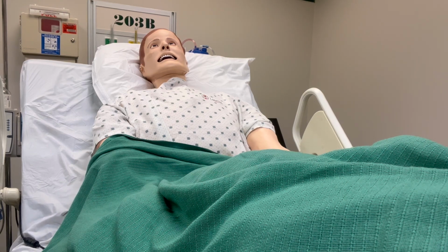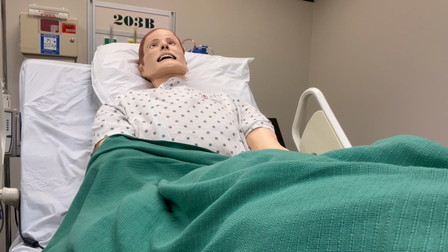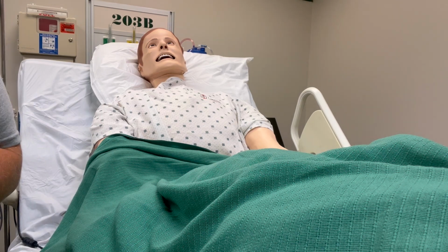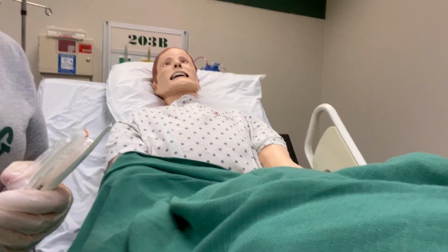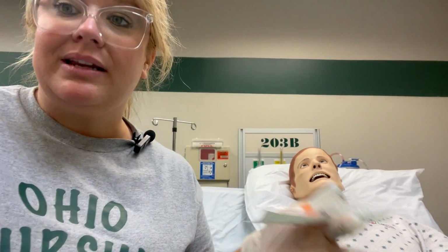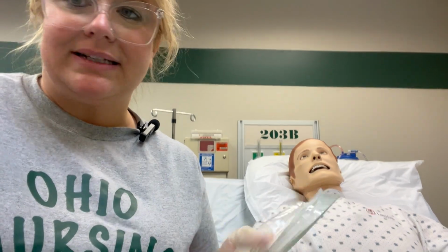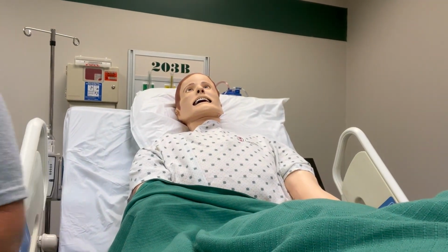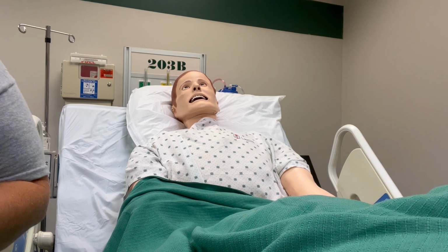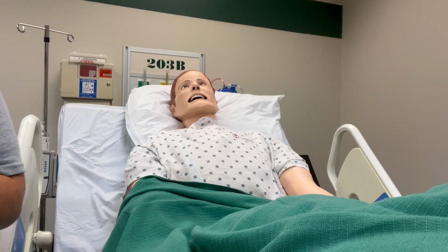For a subcutaneous injection, sometimes referred to as a subcu injection, we are actually injecting the medication into the adipose tissue of our patient. Generally, medications that we are going to use a subcutaneous injection for are insulin, heparin, Lovenox or enoxaparin. There are several different insulin and non-insulin medications that we can give. As far as needle size for insulin, typically we're going to use a 0.3 to 1 ml syringe.